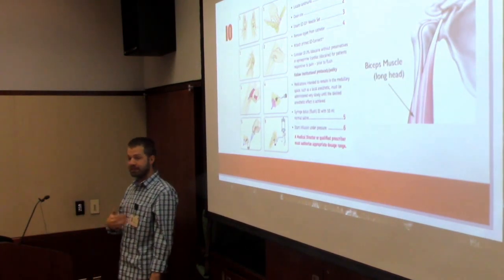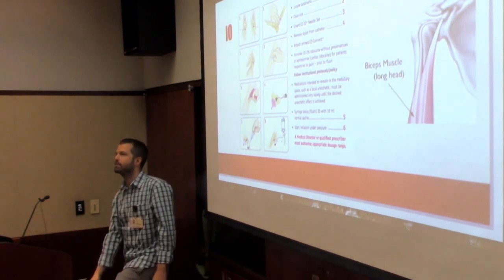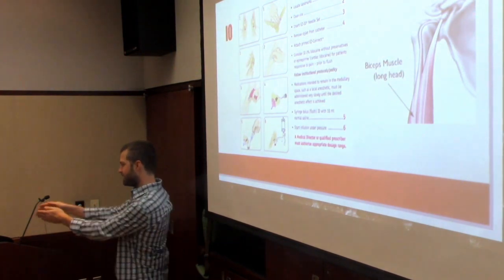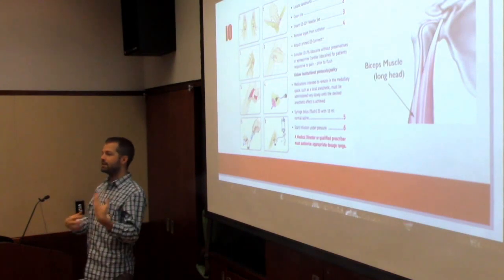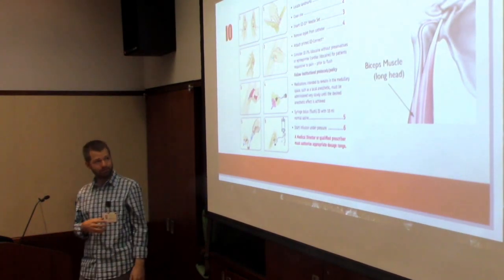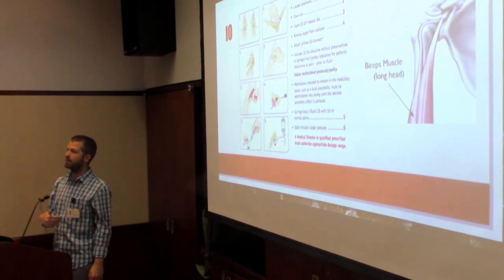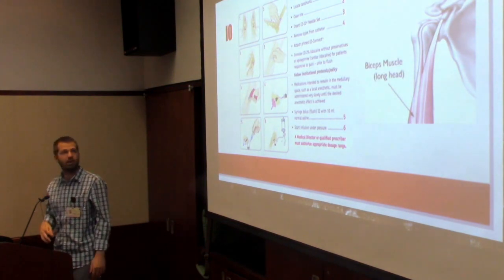And so from time to time, when I'm thinking about doing an IO, I'll often just touch my own leg and be like, so that's where I'm gonna go. It's gonna be medial, it's gonna be kind of in this direction, and if I can't feel the anatomy on someone else, I have to have some way to remind myself. And so that's what I found to be really useful for IOs, is thinking about where would I put it in myself. Imagine the person, if I can't see their anatomy, that's probably where I would go approximately.